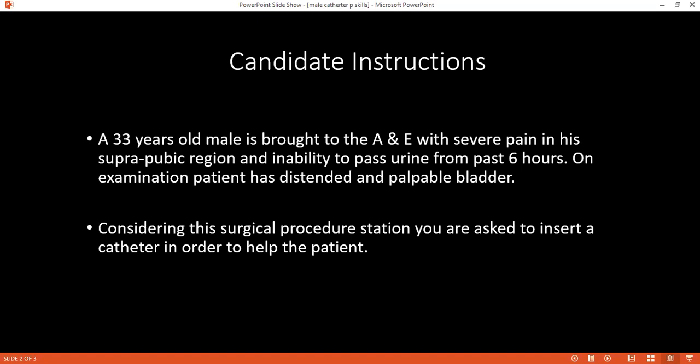All right, but I wanted to ask you, where is my question? When you're trying to sterilize the patient before you even insert the catheter, what are the things that you have to keep in mind which can lead to an immediate allergic reaction?